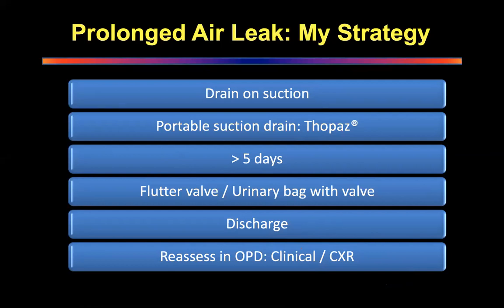Okay. Then I call him back into the outpatient the next week. Okay. I give him 5, 6 days for the thing to settle. I look at him clinically, and I want to see that flutter valve. And I ask him to cough. If he coughs and I see a flutter in the valve, a large flutter in the valve, then I will say, okay, it's still leaking. And I will send him back and call him back.